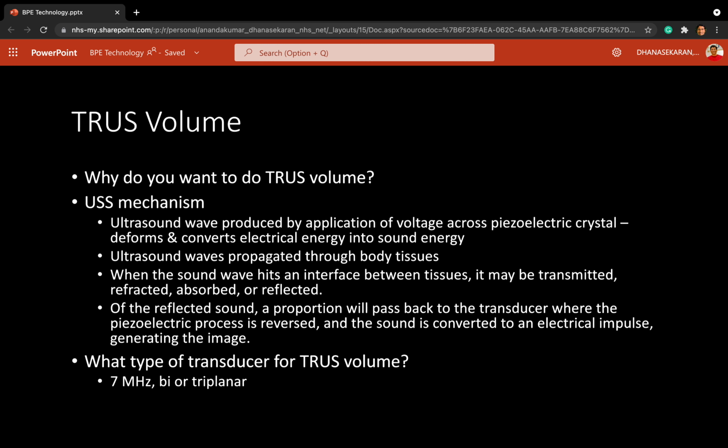I can't recall it. Yeah, if the frequency is high, the depth of penetration of the ultrasound wave is less. So, for example, for prostate, we are using 7 megahertz. If you are going to do ultrasound for the small parts like testes or scrotum, you may require much higher frequency, like 10 megahertz or even up to 12. That will give you the surface anatomy and less penetration. But if you have to image a kidney, for example, for a PCNL puncture, you will need only 5 megahertz. So as the frequency increases, the penetration decreases. So high frequency probes are needed for the skin and near the skin surface organ examination.